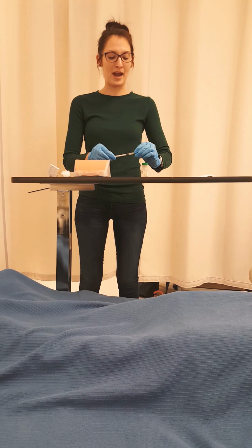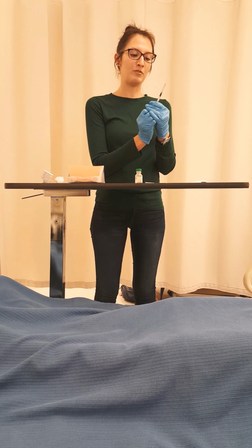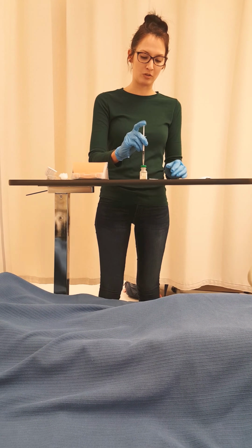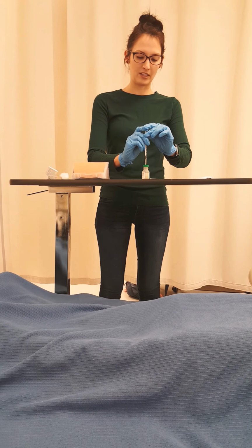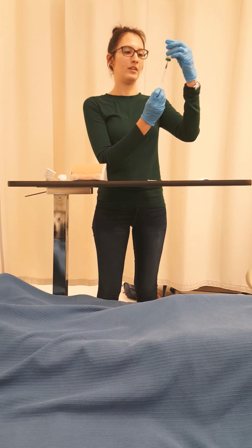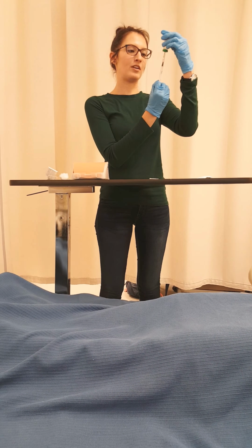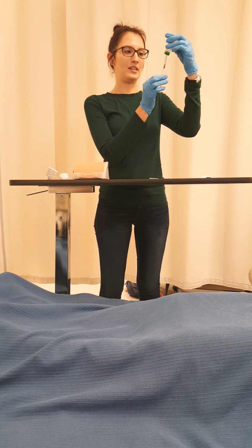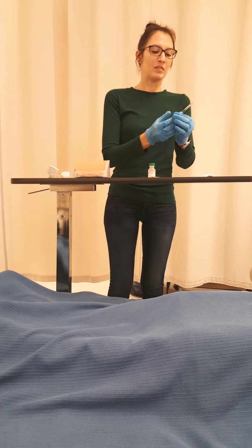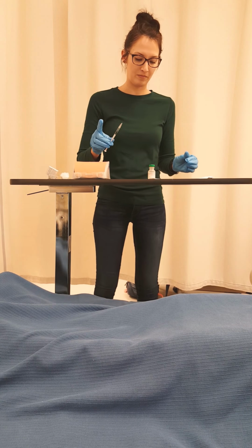So to prepare our injection, we are going to draw up 0.4 mils of air into our syringe. We are going to inject that air into our vial. We are going to draw up the medication. As I'm drawing up this medication, I am checking for a second time our 6 rights for medication administration. Right patient, right medication, right dose, right route, right time, right documentation.